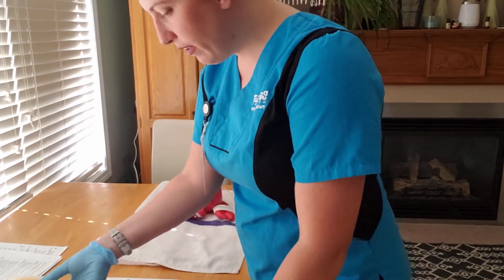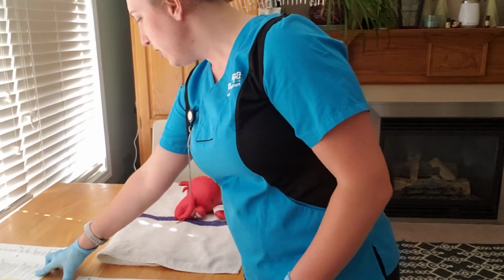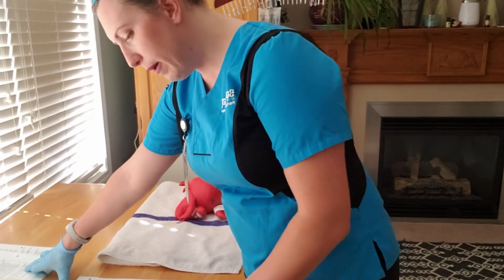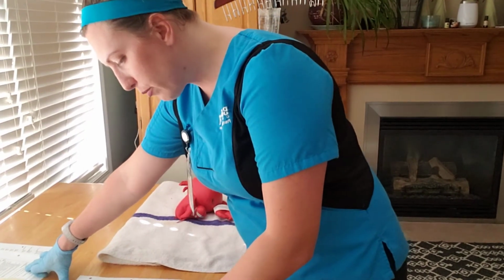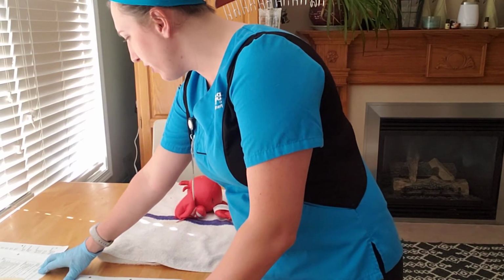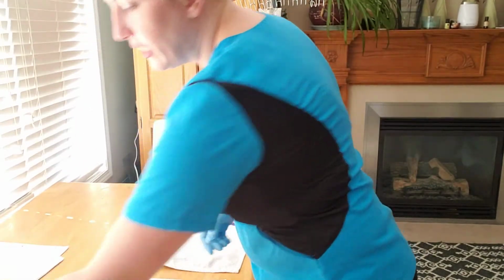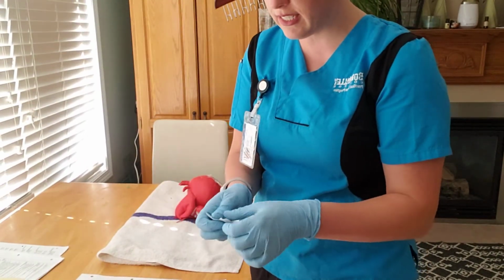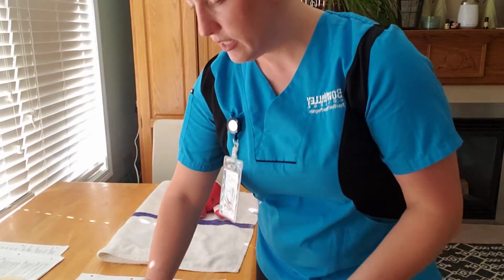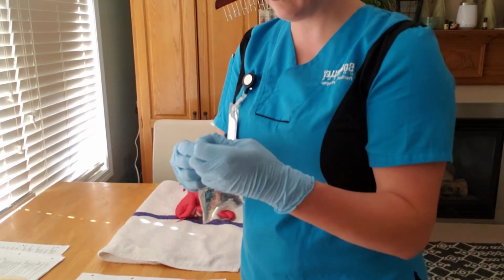So before I fill this bag, I'm just gonna double check according to the monograph. So 25 to 100 bag, I have a 50 ml, so it's in the parameter, 0.9% saline. That's on the dilution for IV infusion as compatible. So we're gonna go ahead and inject our medication, ranitidine, into our mini bag. So what I'm gonna do is scrub the port on the mini bag.